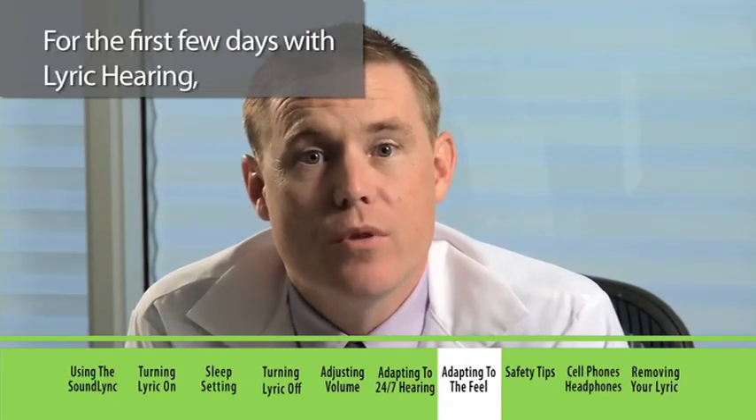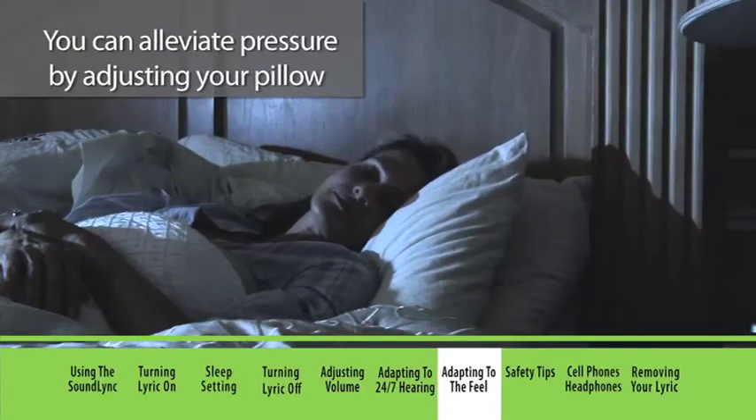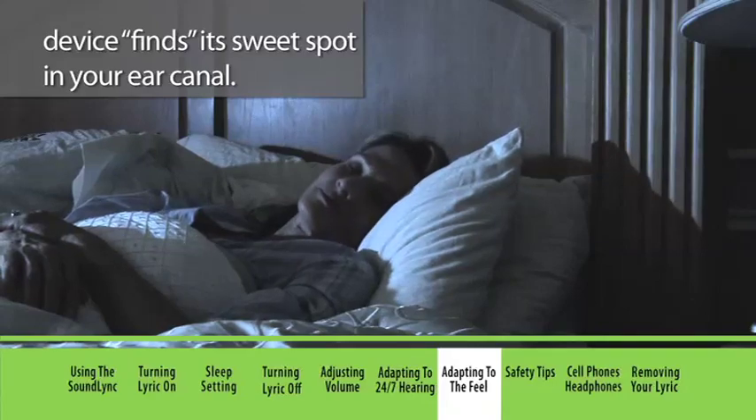For the first few days with Lyric hearing, avoid sleeping with pressure directly on your ear. You can alleviate pressure by adjusting your pillow, or if possible, try sleeping on your back until the device finds its sweet spot in your ear canal.